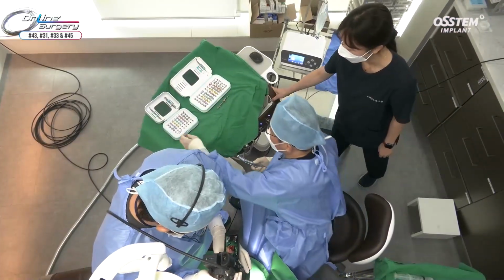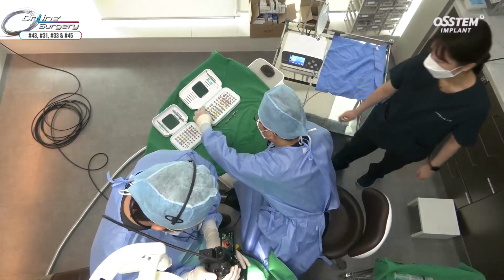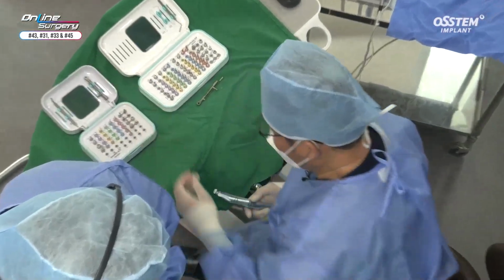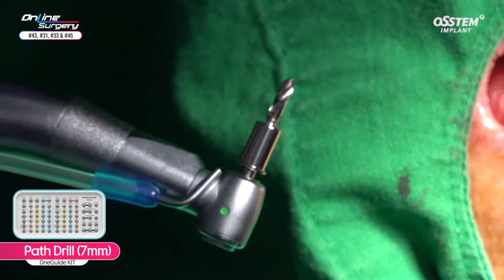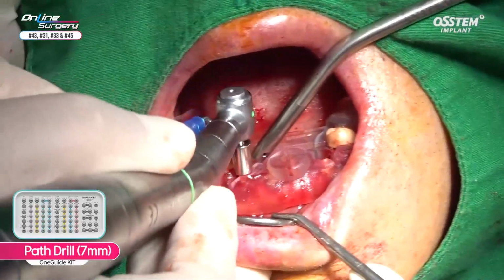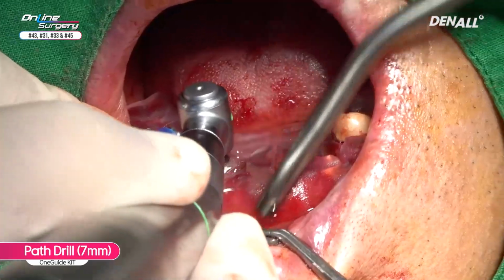Because it's all extraction socket, there's no need for tissue punch or flattening drill. Because here it's a canine area, path drill will be used. For path drill, we need to start with shorter one. This is 7 millimeter drill. Because it's extraction socket, it's not going to come in contact, probably.